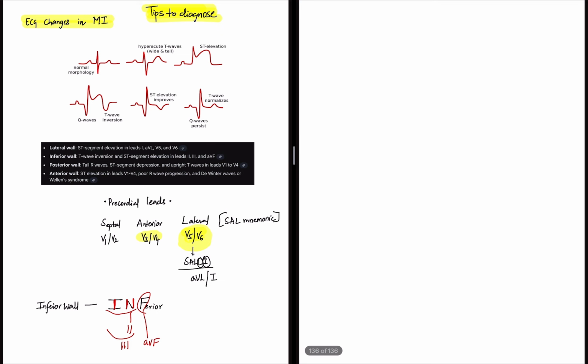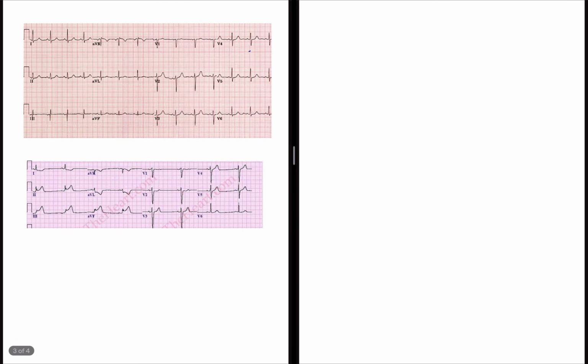Now let's do an exercise to consolidate our learning. A case of chest pain comes to you, plus cardiac biomarkers like troponin are elevated. Now you have done an ECG to look for ST segment elevation. Coming back to this side of the page, you have an ECG strip in front of you. So what are you trying to do?